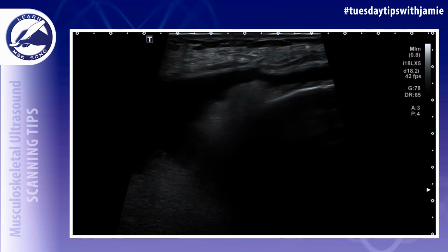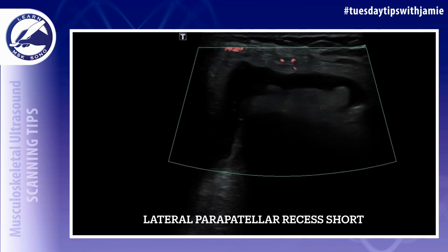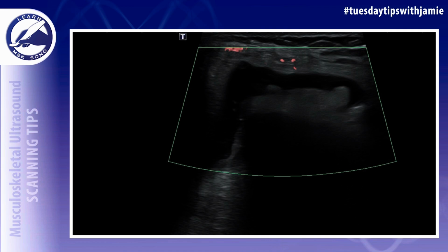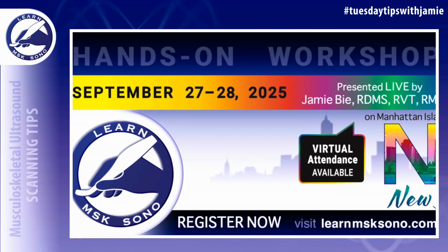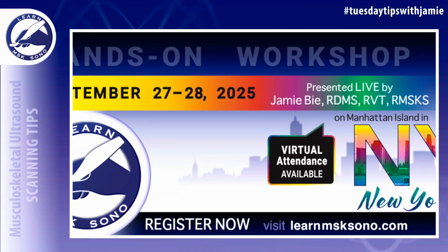The knee joint should be inspected for any joint effusion or synovitis present. When the fluid has a complex appearance, it's important to be able to differentiate between effusion and synovial thickening. Power Dopplers should be used to detect the presence of hyperemia, which is indicative of synovitis. If the collection is compressible with transducer pressure, then this confirms that the fluid is not synovial tissue, confirming a diagnosis of effusion.